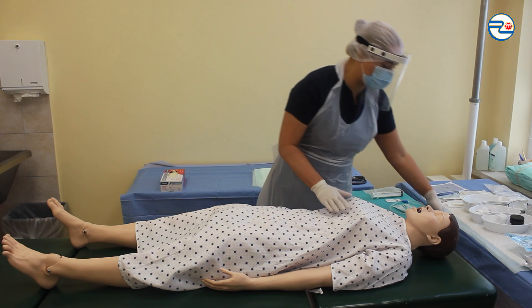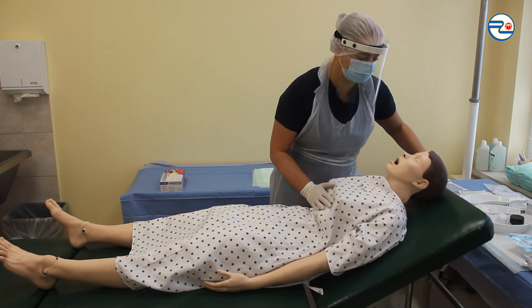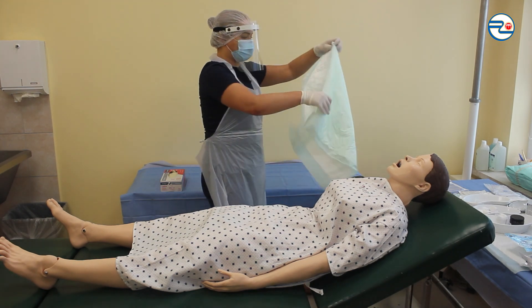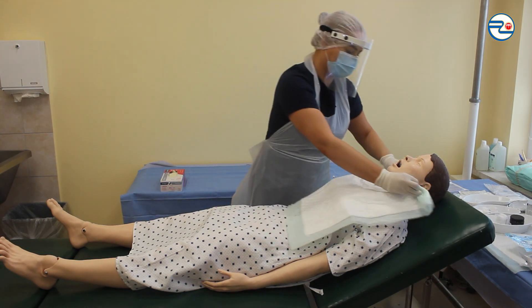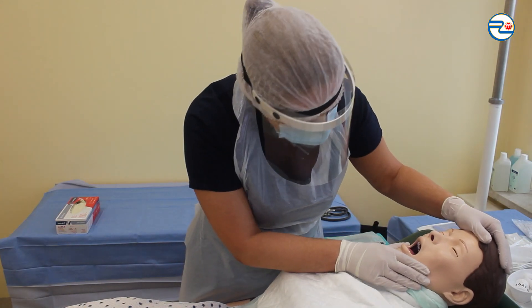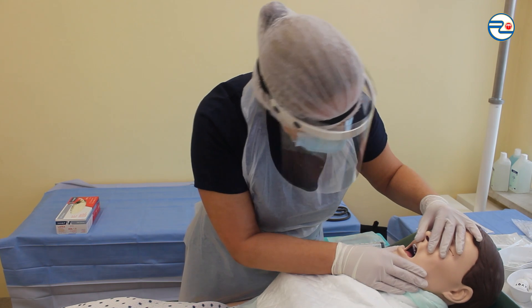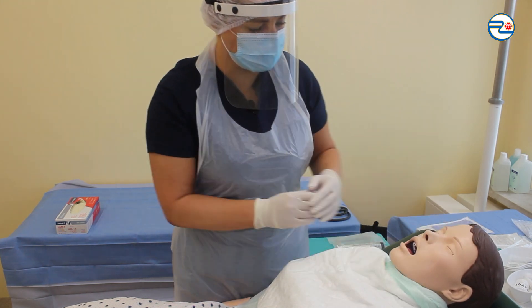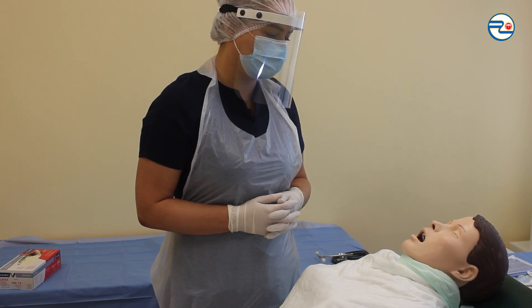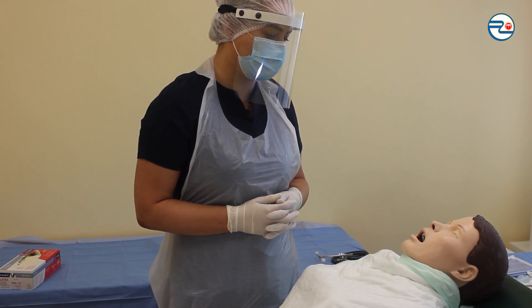Giving the patient a half-sitting position and putting a disposable drape under the patient's chin. Checking patient's mouth and nose cavities — there are no artificial teeth plates. Asking patient to breathe strongly through the nose to determine through which cavity air flows easier.